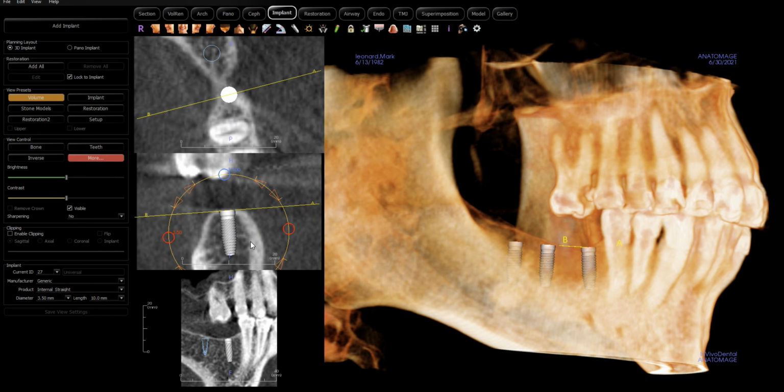I would guarantee that those lecturers that are out there that talk about how easy it is to graft around an implant, just slap a membrane on, clearly are not looking at the outcomes. Guaranteed. With that said, there's maybe some that do it very well, but they're not slapping the bone there. They're doing a lot of steps to make sure that that bone is stabilized. My favorite way of doing it right now is a titanium mesh membrane that lives over the top of the implant and comes down like so, and the membrane is screwed into the implant.